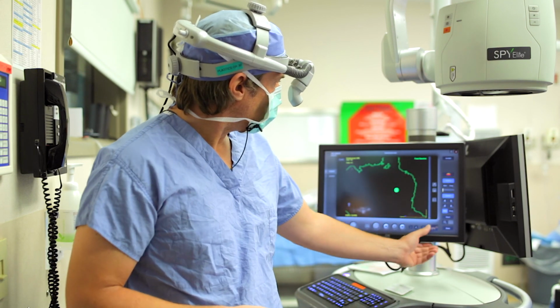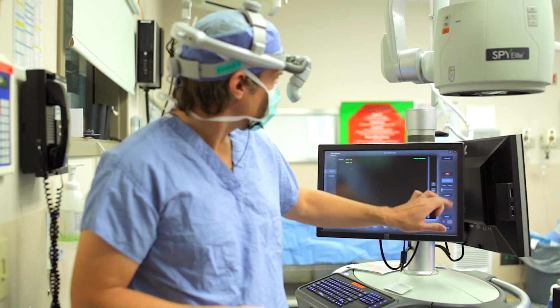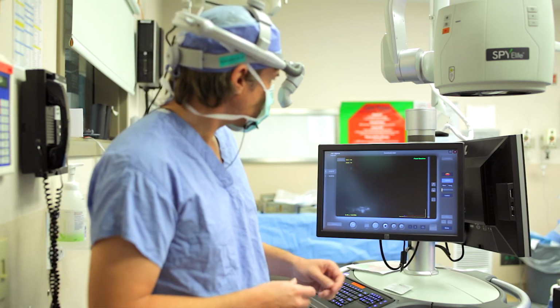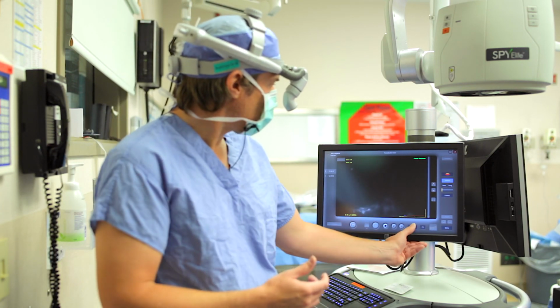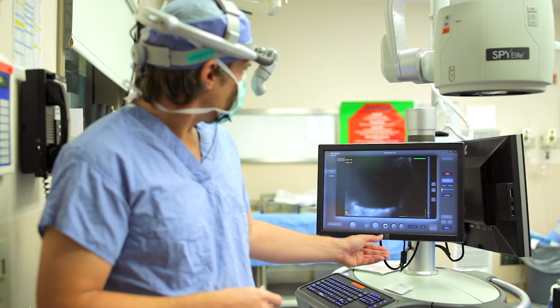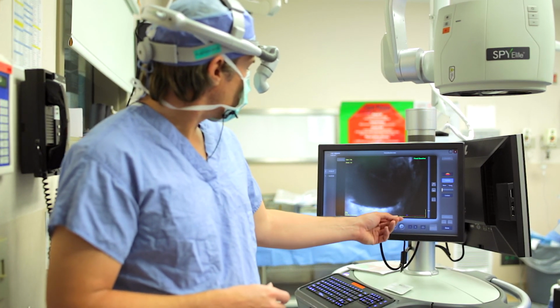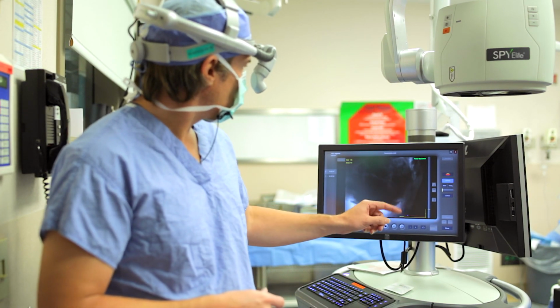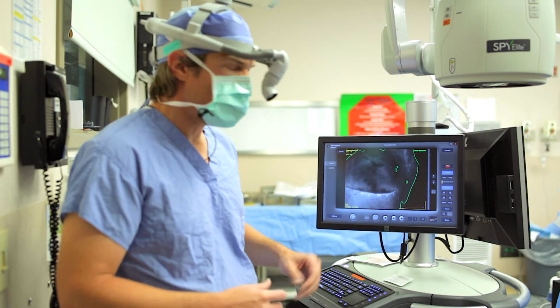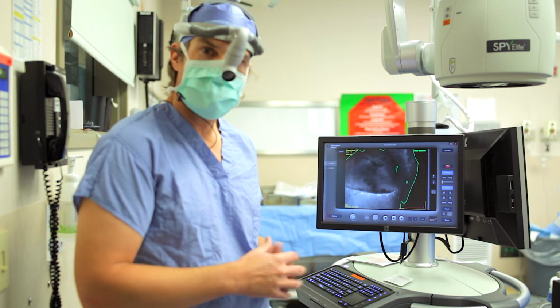So now what we've done, we've made an intervention, we've deflated the device, so we've taken all of the stress off of the skin envelope, and we're going to see that it's going to make a difference in the perfusion overall. I can skip ahead to here. Now I put my contour numbers up. Now it's flat. You get the sense that it's a flatter surface. I don't have any stress on the perfusion.